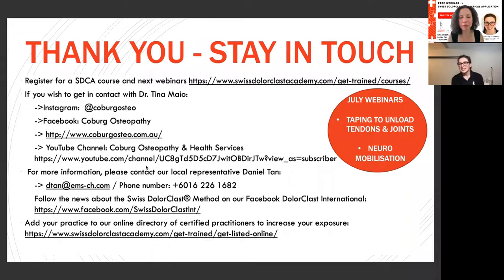Yeah. So again, if we've got a metal knee, or depending on what the material is, it might not be very comfortable. So if you're treating the soft tissues, you can use the Evo handle on the soft tissues around the joint to try and help with mobility there. So you can use shockwave, but just be mindful of where your shockwaves are going and the anatomy of the knee.